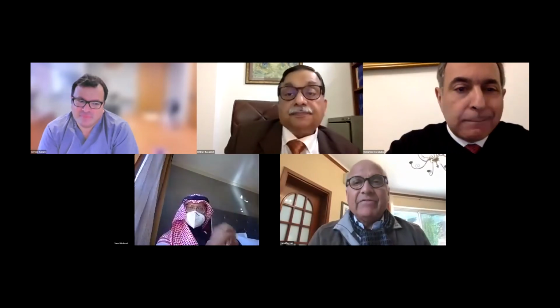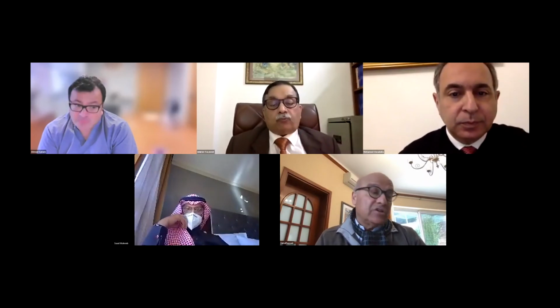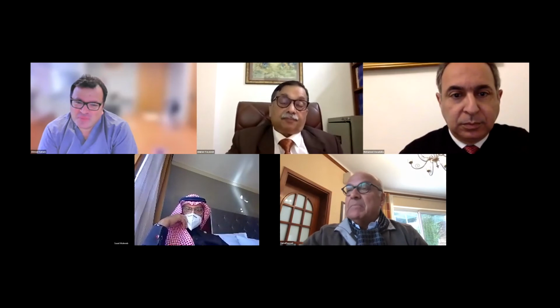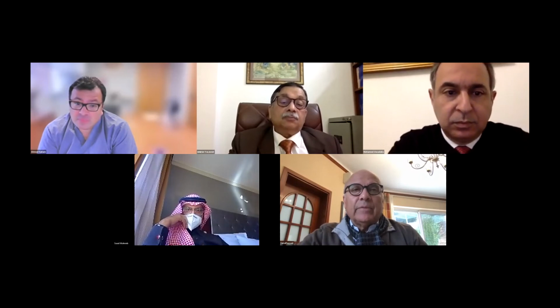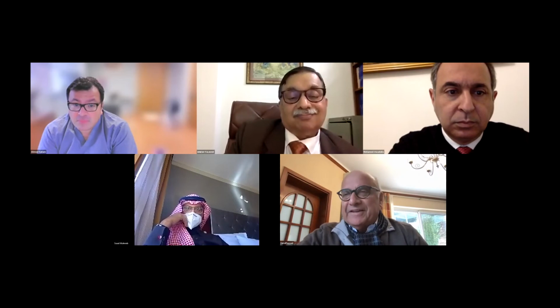Yes, I have a comment. Ahmad, a great presentation. Thank you very much. Always informative, very elegant and nice. But I would do maybe differently. I would not go right away to retinectomy. I would peel and peel. Maybe I'm used to stay inside the eye for more than 3-4 hours.